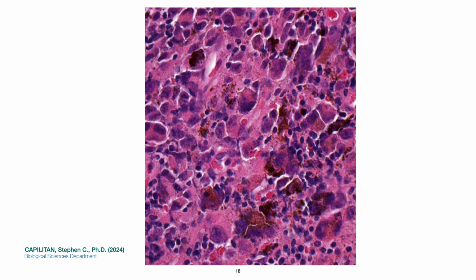Clinically, melanomas appear as irregular, variably pigmented, raised or flat lesions that may be prone to bleeding. In this example, the tumor cells are large, irregularly shaped, and have abundant cytoplasmic melanin pigment. Unfortunately, this typical appearance may not always be apparent, particularly in metastatic tumor, for example in a lymph node specimen where the primary may be unknown.